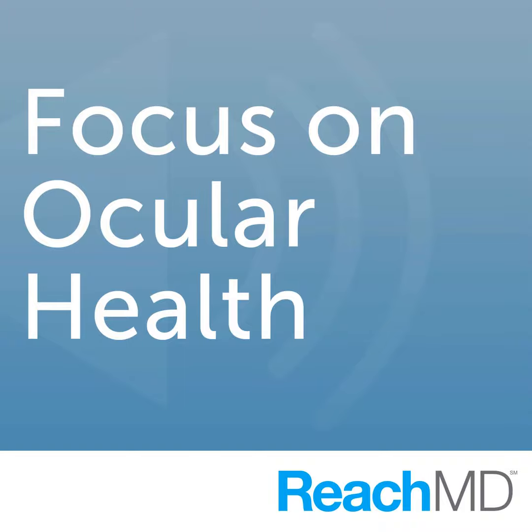We're going to talk about ways of looking at the retina. We both know that there are many ways to examine the retina, from the direct ophthalmoscope, seeing only the optic nerve, macula, and central vessels, to indirect ophthalmoscopy, which enabled us to see the entire retina out to the periphery, and also fluorescein angiography, which enabled us to evaluate the retinal vasculature with fluorescent dye. Now, new technology gives us almost a pathology type of slide view of the layers of the retina in a non-invasive way. And this is called OCT, and I'd like for you to talk a little bit about that now.